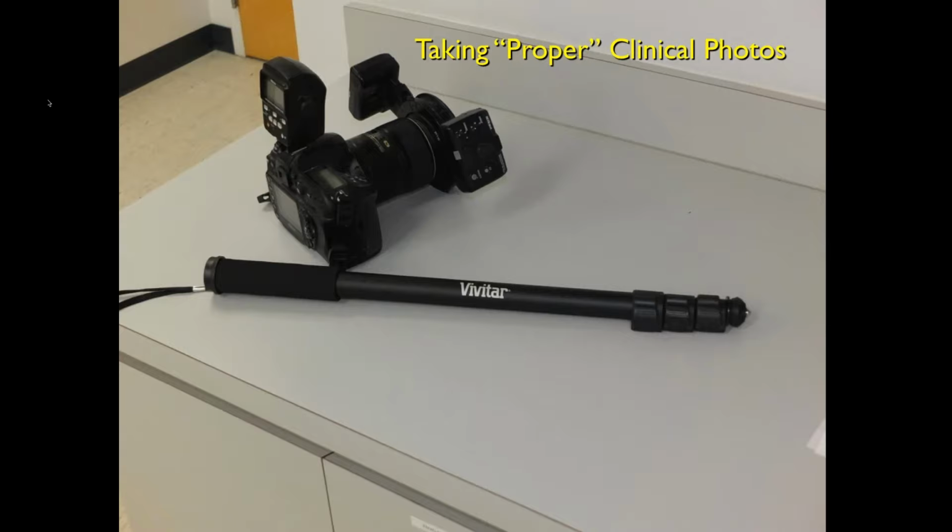Now, I'm going to digress just a little tiny bit here and talk about clinical photos. What I want to show you is what you need to do, and you can share this with your accounts, to take a proper clinical photo. So what we do is have the patient stand up and tell them to straighten their head. And they never have it straight. So you need to say no, a little bit left, no, this, okay, there you go. And they always think it feels funny because nobody stands up with their head straight. And if you have something horizontal in the background, that's nice too, because it helps you define the horizontal axis.